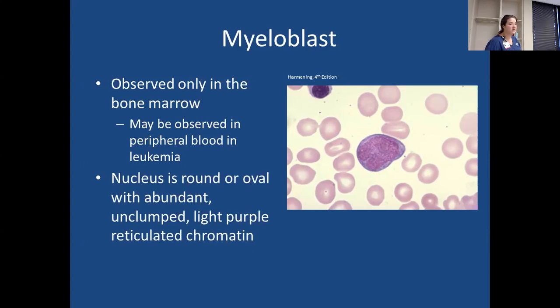All right, so notice your nucleus, round and oval. The nucleus chromatin is very fine. It's not condensed at all. Notice that your nucleus takes up the majority of the cell, right? So here's your, and I apologize if the screen prohibits the images. Notice that your nucleus comprises most of the cell, right? So that high nucleus to cytoplasm ratio. And notice that you have the presence of some nucleoli. So there's one there, it might be hard to see in this image. Definitely a nucleoli right there. Guys see that?